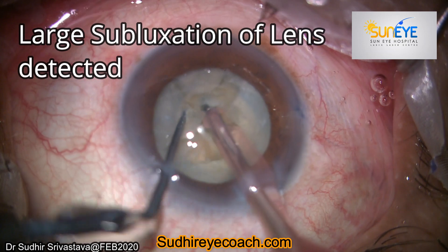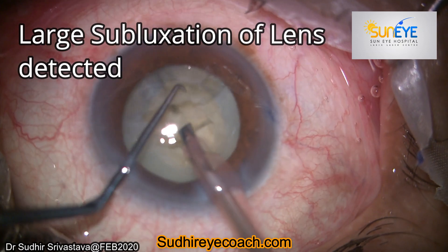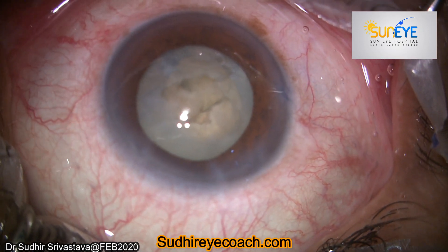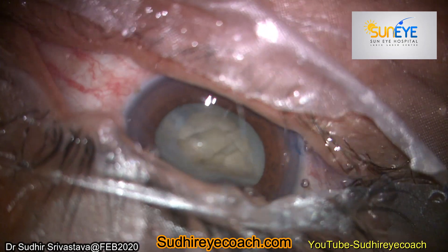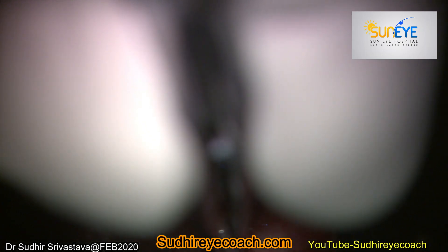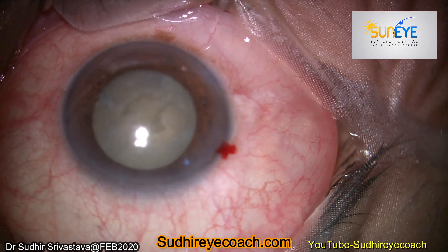Suddenly I realized there was a deepening of the anterior chamber in the superior part and there was a large subluxation of the lens. Because I was doing my surgery under topical anesthesia, I stopped the surgery, gave peribulbar anesthesia, and again prepared the patient to continue surgery.